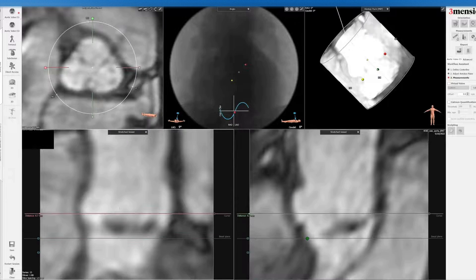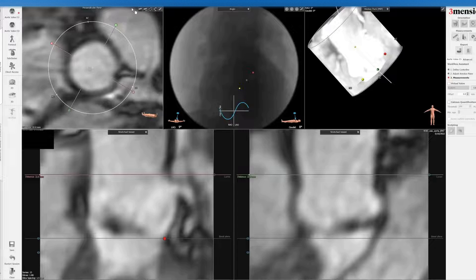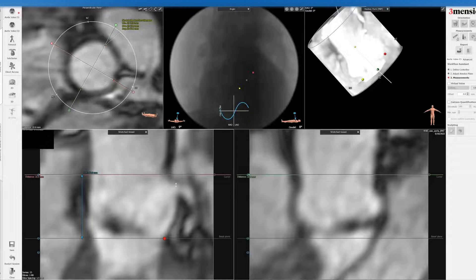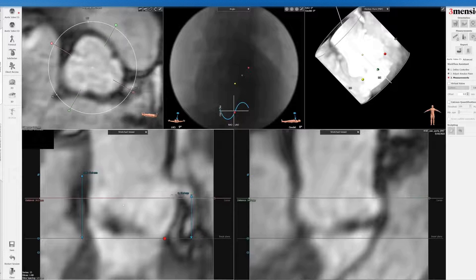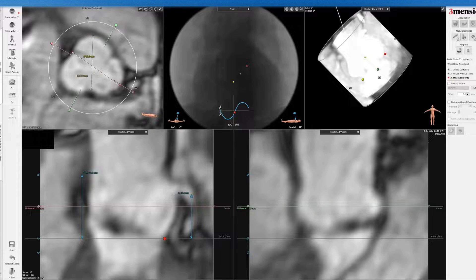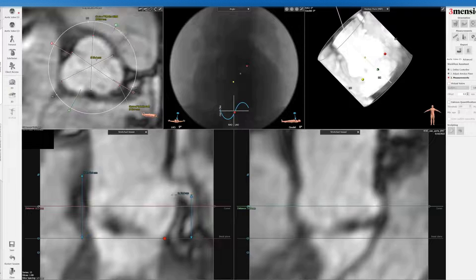Next, you want to go up to look at the aortic root where the STJ is. Sometimes artifact may make it difficult to see the left main takeoff, but you can see it here very nicely. You can do a measurement of the sinotubular junction and label that. This is the sinus height — right click on the sinus height. Then you come down to look at the left main separation. This is a very clean study for MRI, though sometimes there's more artifact. You can also look at the sinus of Valsalva here — the commissure, left sinus, right sinus going to the commissure, opposite commissure, and then the non-coronary sinus going to the opposite commissure. You can actually see the root anatomy quite well using this software.